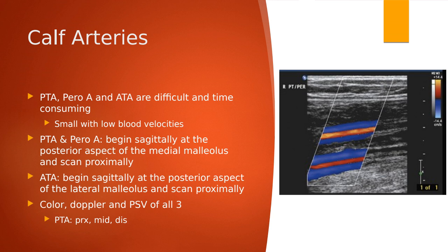And remember, we're talking about patients who have arterial disease. So when you guys are scanning each other in lab, these arteries are going to kind of light up like a beautiful Christmas tree. But when you're doing a real patient in clinic, these patients have arterial disease.